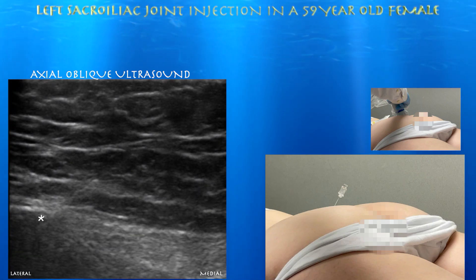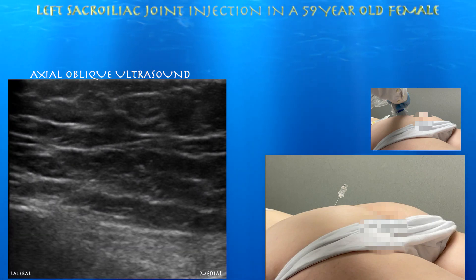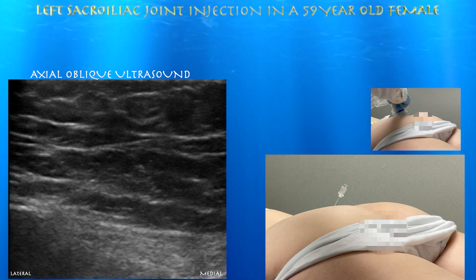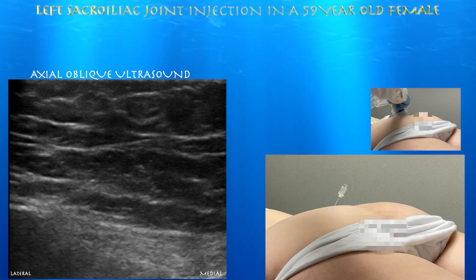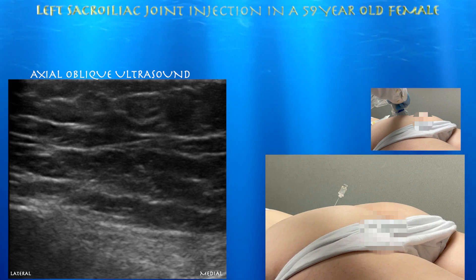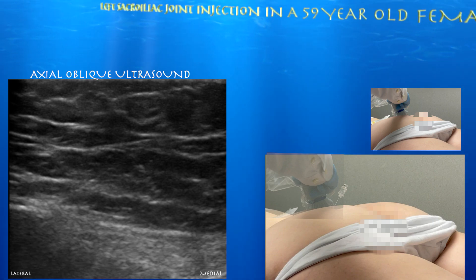Here we're going to go over a left sacral iliac joint injection. You can see the needle in the patient on the bottom right corner of the screen. Unfortunately, I was unable to get a good video of the procedure, but this is actually the needle inside the patient during the procedure itself. Above that is an image of the probe in an axial oblique plane, superimposed on the needle to get a rough estimate of the orientation during the procedure.